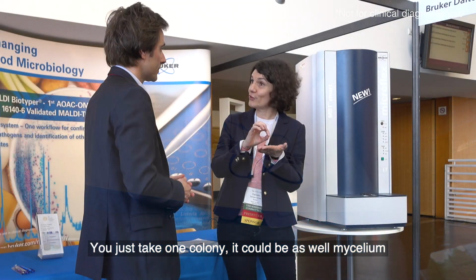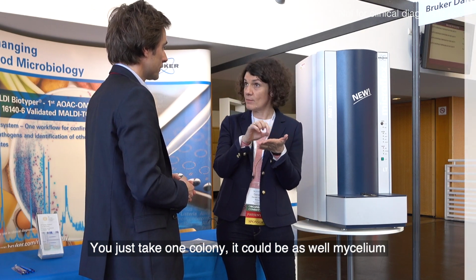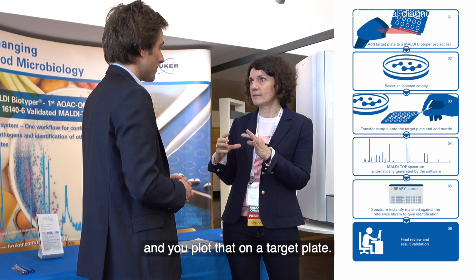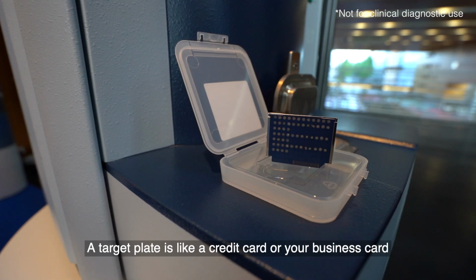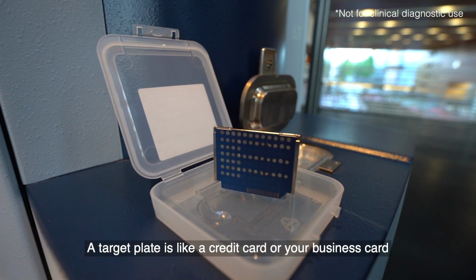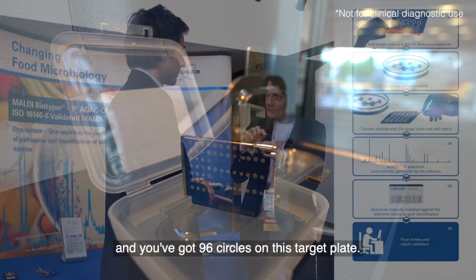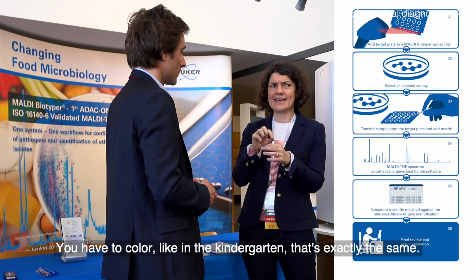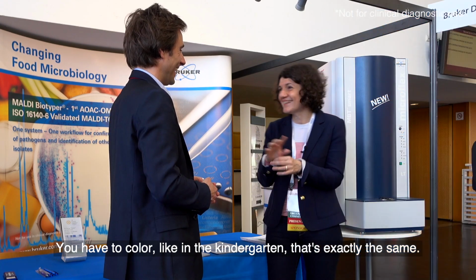So you just take one colony. It could be as well some mycelium, fungal mycelium. And you plot that on a target plate. A target plate is like a credit card, exactly the same, or your business card. You've got 96 spots on this target plate, and you have to color them like in kindergarten. It's exactly the same.